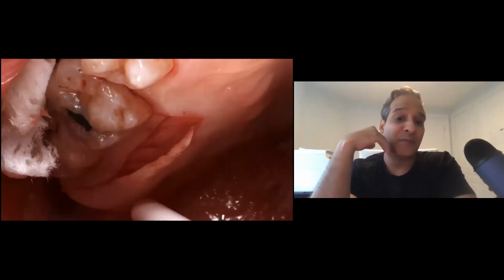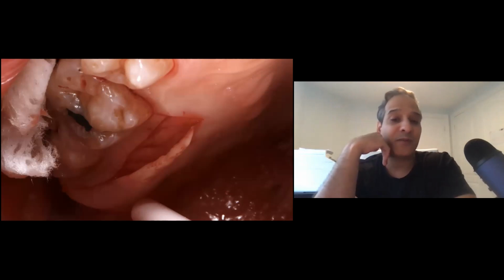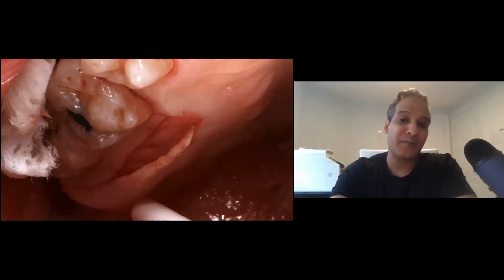And then you can see, because I know where my safety zone is, this is a graft taken just like I take my connective tissue graft, through a single incision. Sometimes you see how I've made a vertical. If you need a little bit more space and it's smaller, you can always make a vertical, almost like an L-shaped incision, to give you a little more access to expose the flap so that you can get the tissue in, access the apical part of the tissue and remove it safely. Here again, because I know where my safety zones are and where the foramen is and where you can palpate, I can easily take a graft all the way back near the tuberosity region.